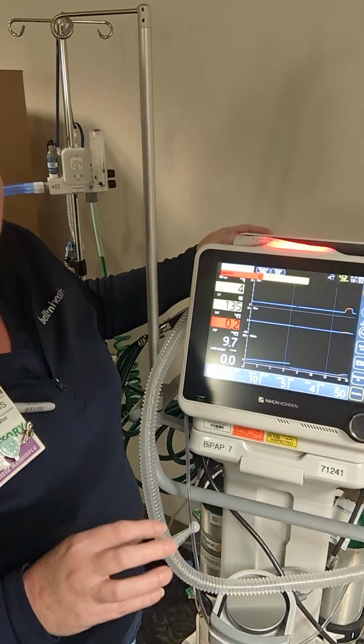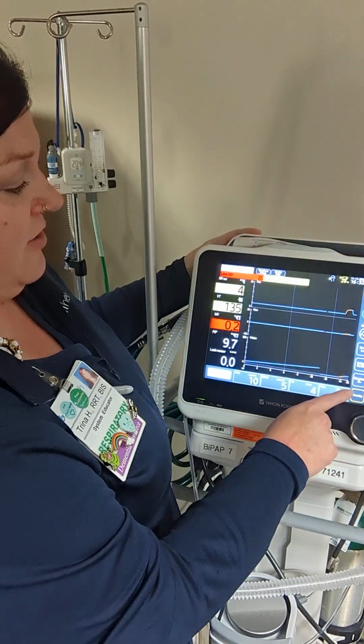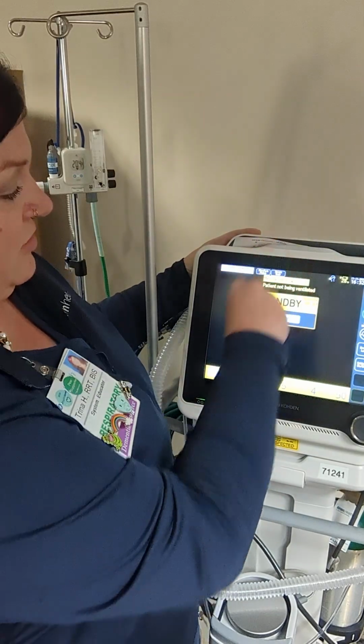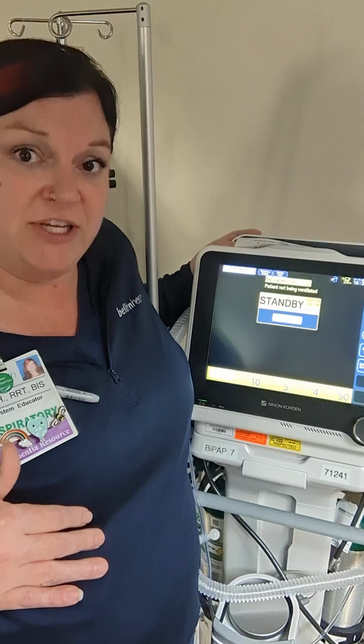Now, if I want to put this machine into standby, I'll hit standby and then it says move to standby. Yes. Confirm. It goes to sleep and you're able to give meds if you need to.